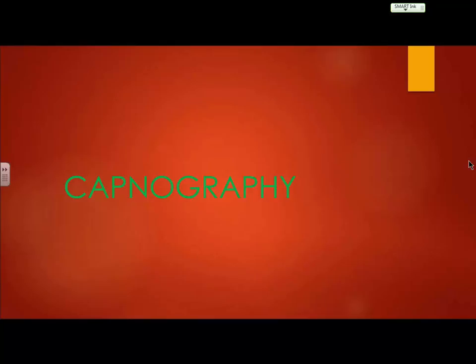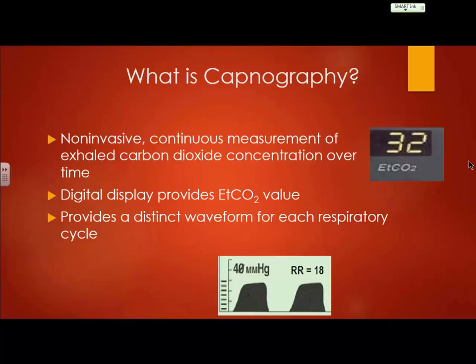So again, I don't want this to be something intimidating to you, because it should not be at all. I feel like it's going to be a pretty easy concept on what we need to know for our standards. So what is capnography? Capnography is a non-invasive continuous measurement of exhaled carbon dioxide concentration over time.